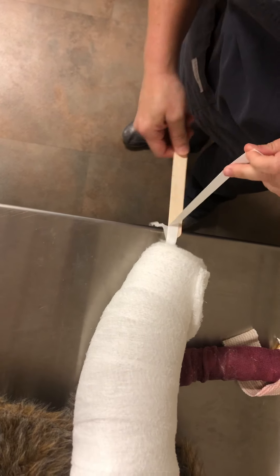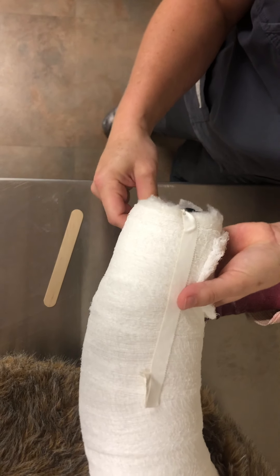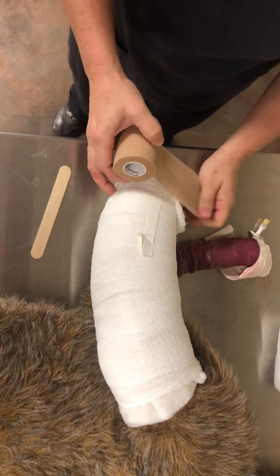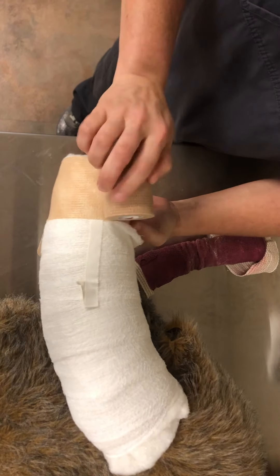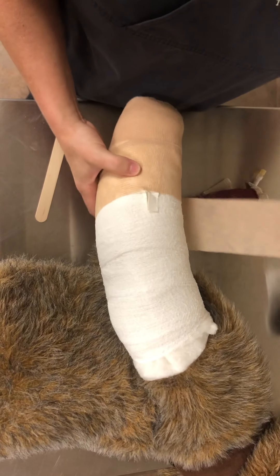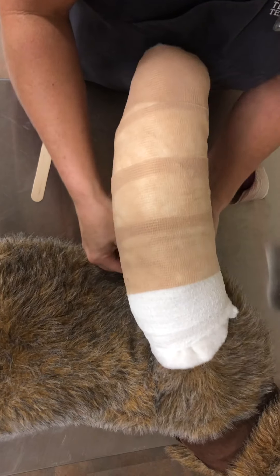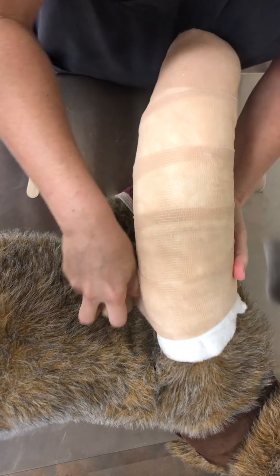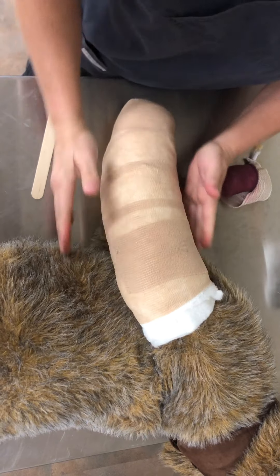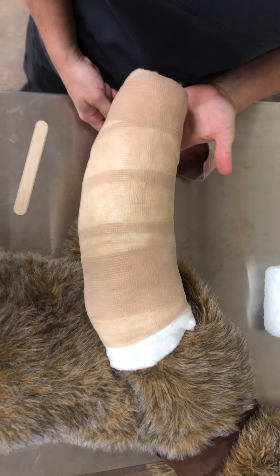Next we're going to take our stirrups and remove them from the tongue depressor. Twist them over at the foot so they can stick back down to the padding — same thing on the other side so it sticks to the medial side. Vet wrap goes on somewhat loose, wrapping around to make sure we cover all of our stretch gauze and roll cotton. This helps with dirt and general wear, keeping your padding clean. This doesn't need to go on tight on your small animals. Tear it there and you're done — notice it's a little chunky, but it would be firm.